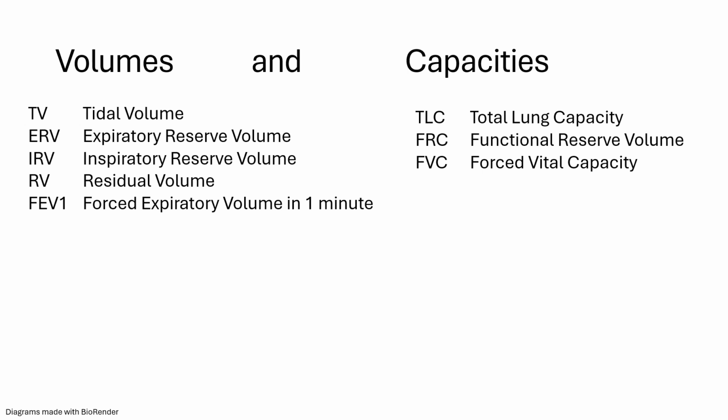In a biology lab, you would probably use a really old-fashioned spirometer that inflates a bellows, which is kind of like the accordion foldy part. And the bellows lays flat when it's not inflated, and then it stretches out when inflated, and you can measure the volume. Kind of like an accordion or a bellows, which is that thing you use to fan a fire. I can directly measure volumes, not all volumes, but enough of them that I can do a few calculations to get the rest.